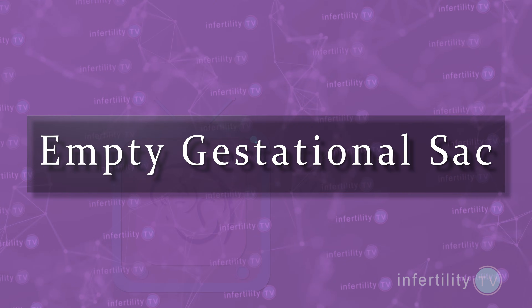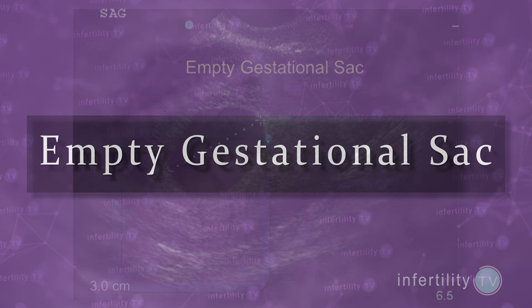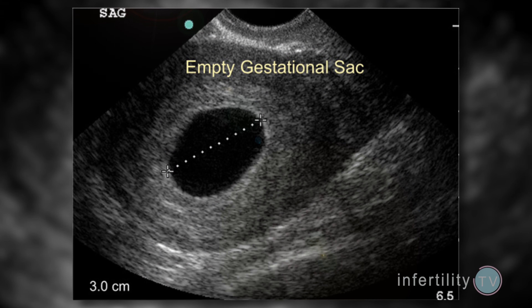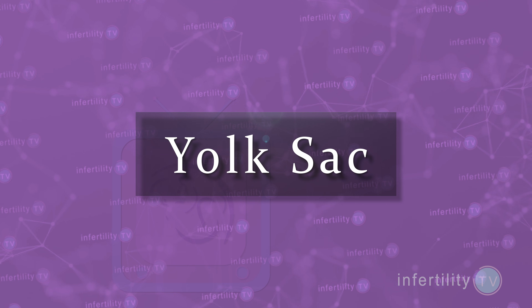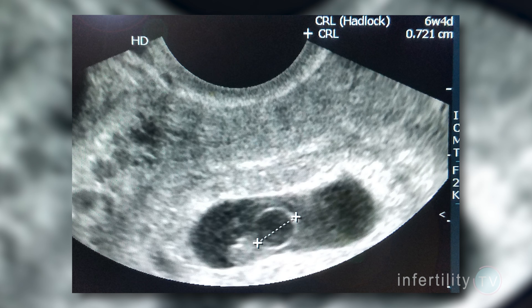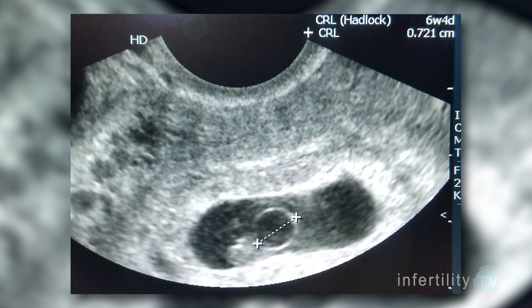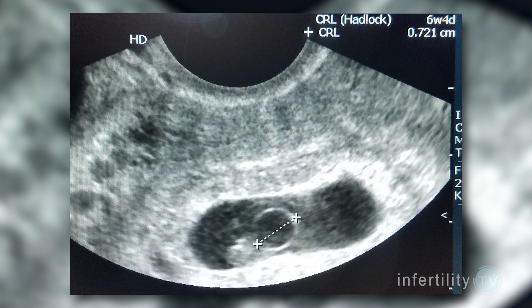We call it an empty gestational sac if there are no other structures inside — in other words, only fluid is seen. The next structure that becomes visible is called the yolk sac. This appears as a white ring located inside the gestational sac. The diameter of the yolk sac can also be measured.